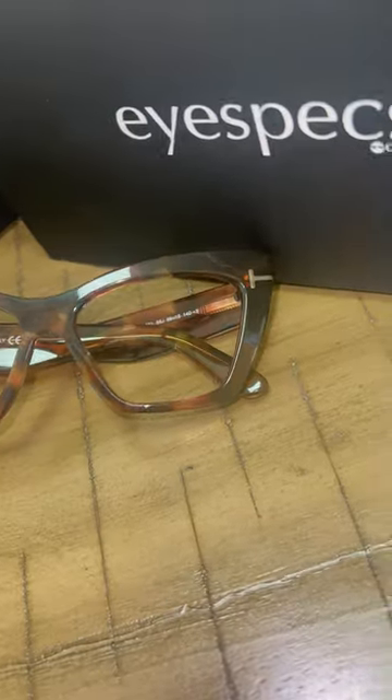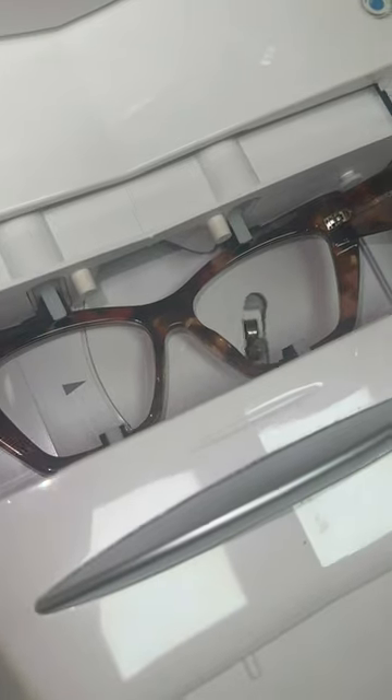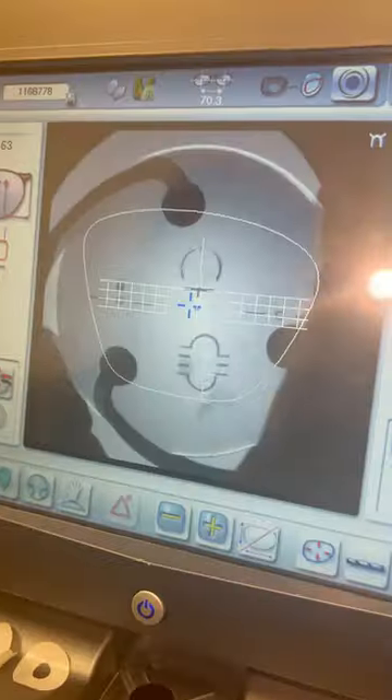Today we're going to show you how we cut and make these glasses. Here we have Vanessa's Tom Ford TF871 women's cat eye glasses. Vanessa got progressive Trivex ultra high definition lenses. First, the optician is going to trace out the frames to get the lens shape.